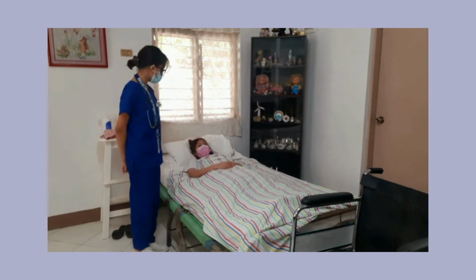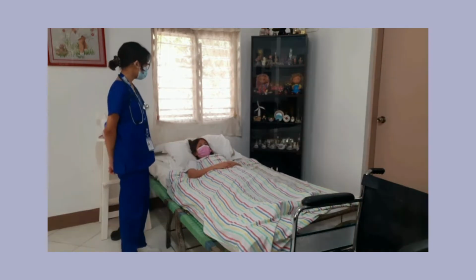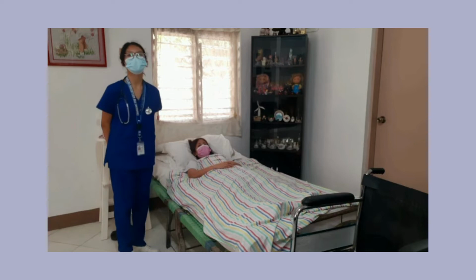Okay, Ma'am Cessna. Today, I'll be transferring you from bed to wheelchair. Is that okay with you po? Yes po. Okay, Ma'am Cessna. You can cooperate with me by following the instructions that I'll be telling you to do. Is that clear po? Yes po. And answer my questions honestly. Okay, ma'am? Yes po. Okay.